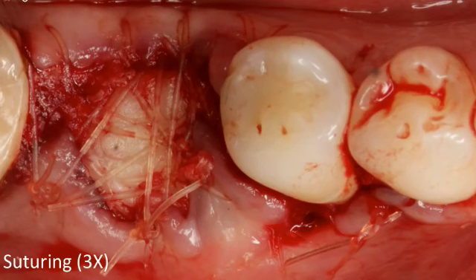Sunny asks how I stabilize the membrane. I stabilize it by tucking it under the flap, placing one layer on top of another — it gets hydrated from the bleeding and adheres. It's not absolutely immobile, but once the flap is repositioned, I haven't seen many membranes move. You can also use bone tacks, but that's a bit of overkill for an extraction socket.